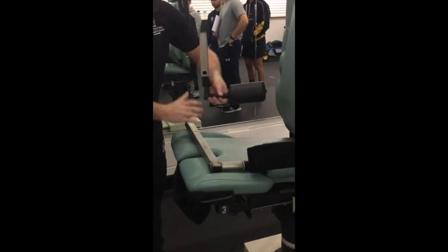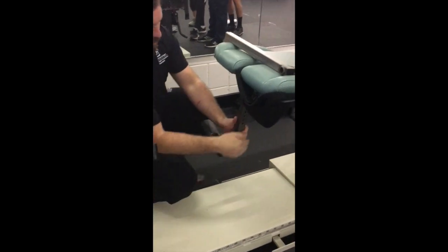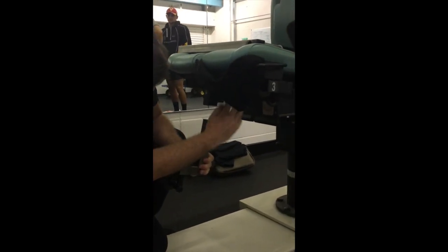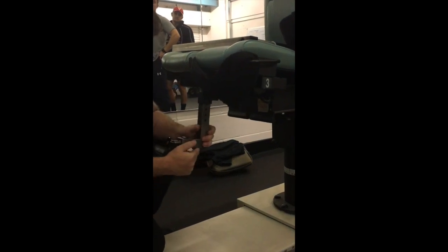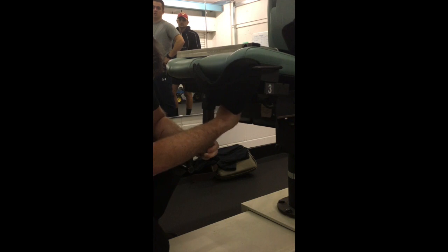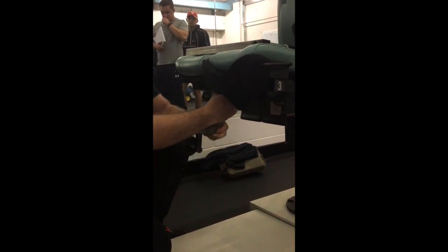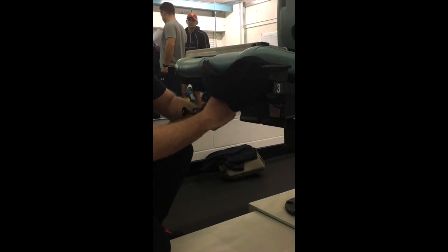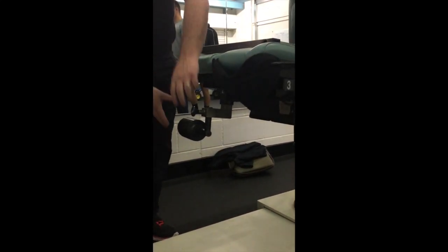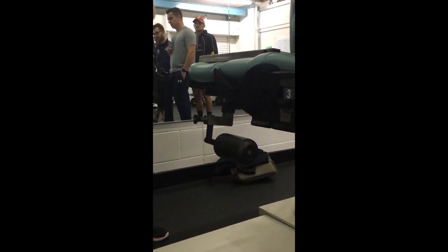And then this one should just slide into there. It should just clip into there. So again, if we're doing right leg, that needs to be the left. Easy, yeah?